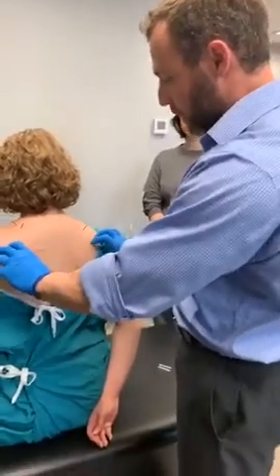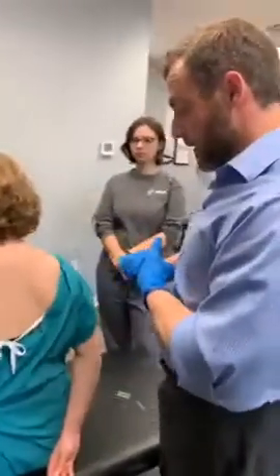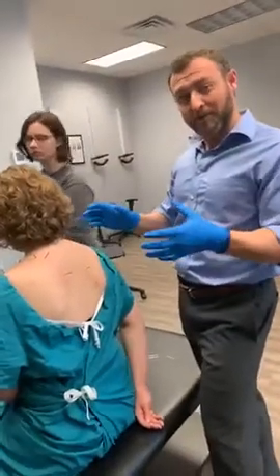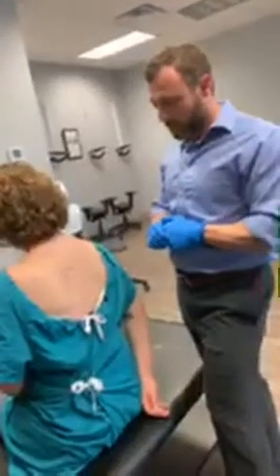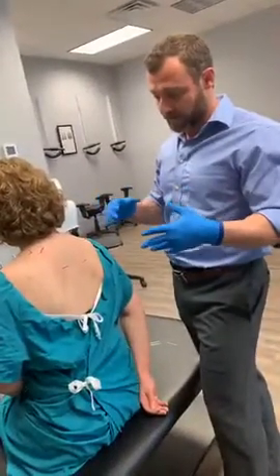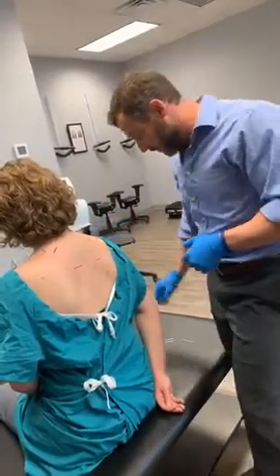rhomboids and around the shoulder blades that typically get tight on patients and where these trigger points develop. Most of the time we don't have to do this more than once, maybe twice. Sometimes you have to do it a few more times, but really dry needling is so effective in how quickly it works in dissipating these knots. You don't have to do it that often at all, and it has a really good long-term effect.